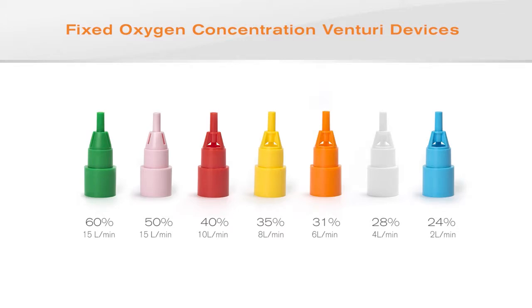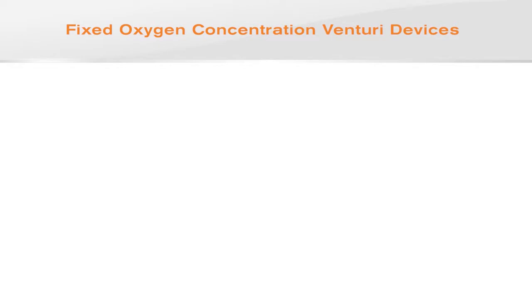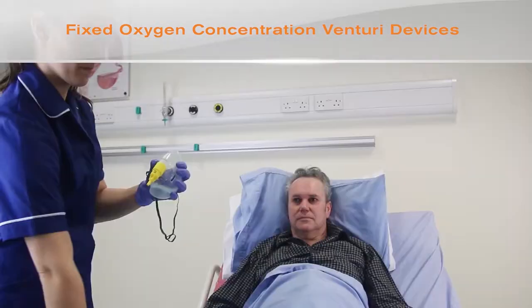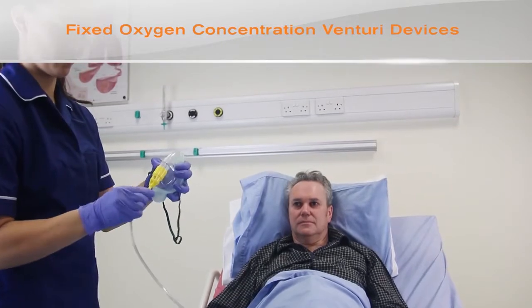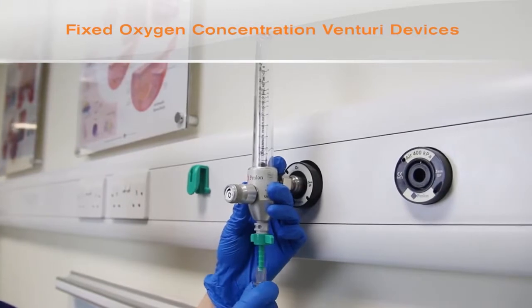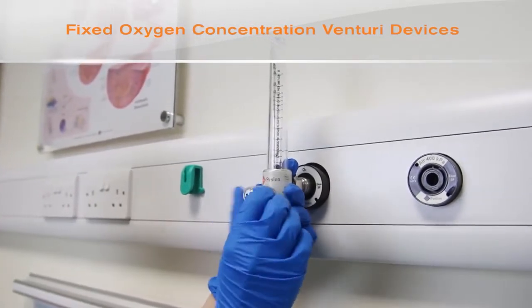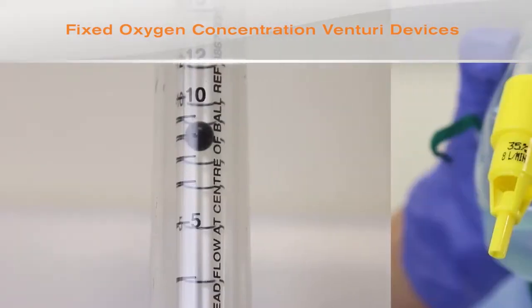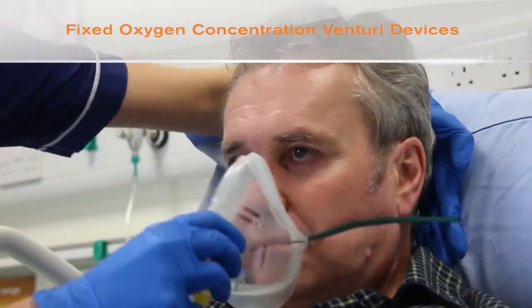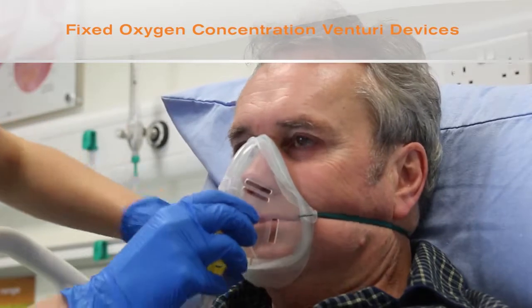When using a Venturi mask, select a Venturi valve of the prescribed oxygen concentration and attach it to the mask. Attach one end of the oxygen tubing to the valve spigot and the other end to the oxygen flow meter. Set the flow meter to the flow indicated on the valve. Place the mask over the patient's nose and mouth to obtain a secure and comfortable fit.